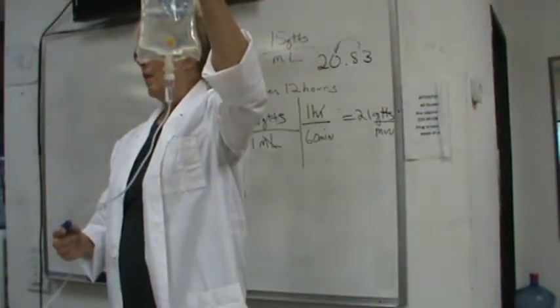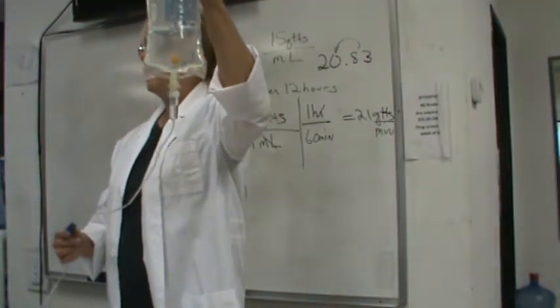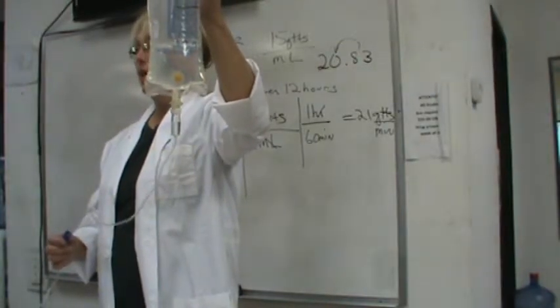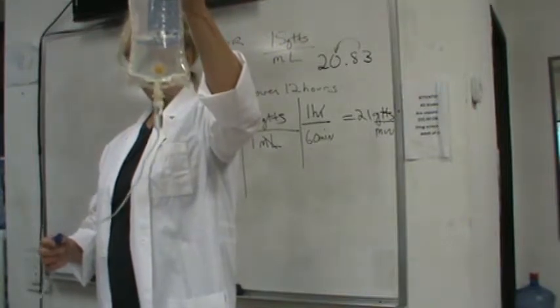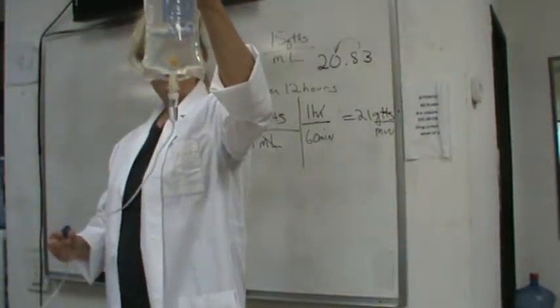Is this our job or the nurse's job? No, it'll be the nurse's job, but you need to know it. If you work in a physician's office as a medical assistant and you're doing infusions, he's going to want you to know this, okay? You can't get out of it that easy, Miss Lynn. That's what you signed up for.